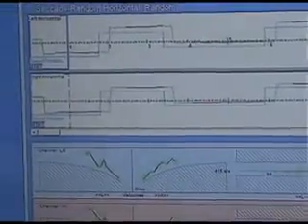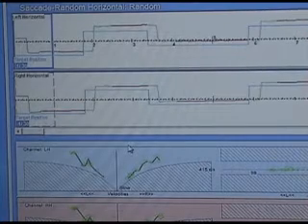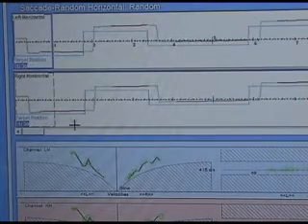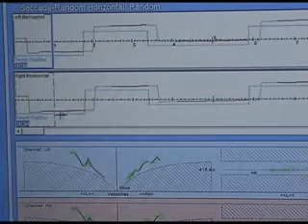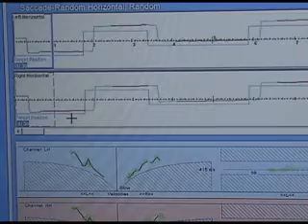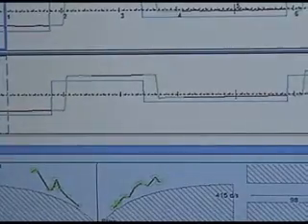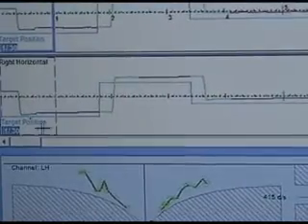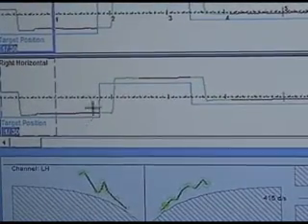If we look at this printout, this is an example of a very normal and good-looking saccade test. The top one is the left eye and the bottom one is the right eye, but we'll just look at the right eye here and zoom in on it. When the dot appears to the right, that's up.